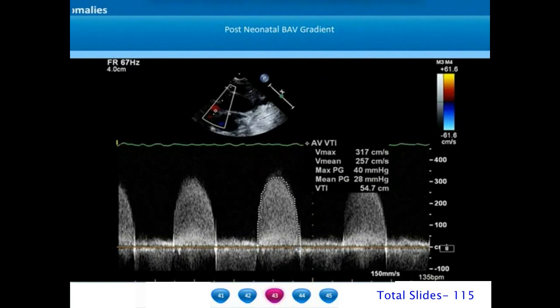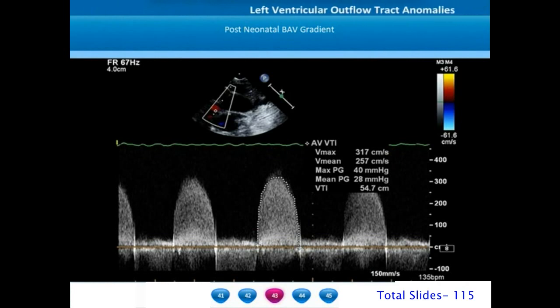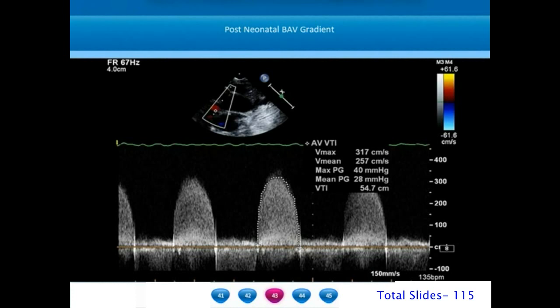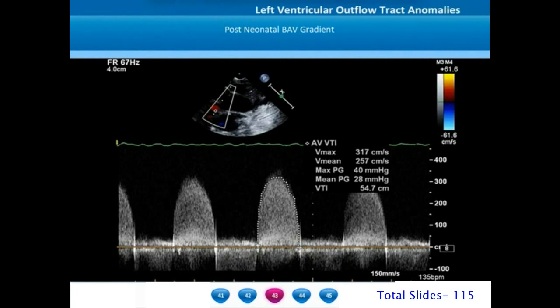After aortic valve valvotomy the gradients have reduced to peak gradient of 40 mmHg and mean gradient of 28 mmHg. We need to understand that the pre-procedural gradients of 70/37 were obtained in the phase of very severe LV systolic dysfunction. However, the post-balloon valvotomy gradients of 40/28 are obtained with good left ventricular systolic function — when LV systolic contractility is good, the gradients will be higher.